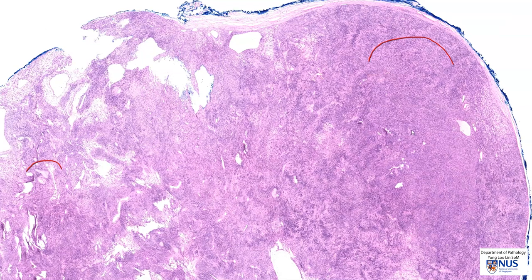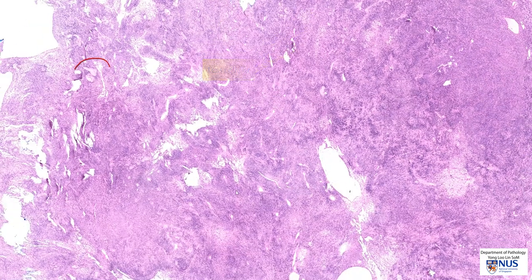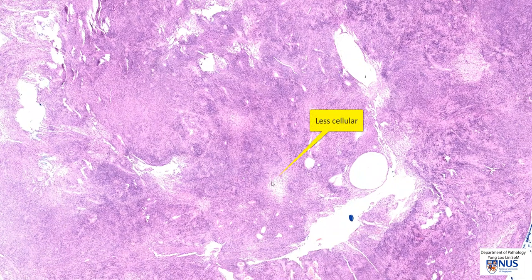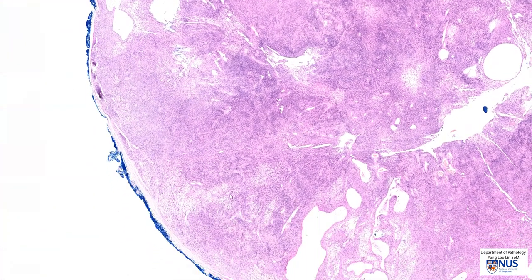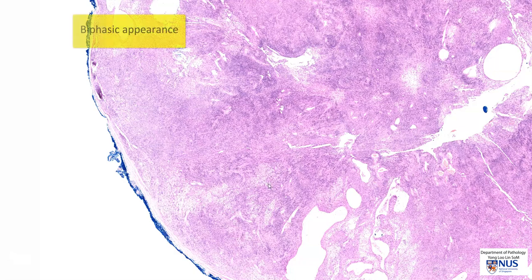Moving around this lesion, we are able to appreciate that there are some areas that are bluer and some paler areas. Some are less cellular, and some are bluer, more cellular areas. This is known as a biphasic appearance on low magnification.